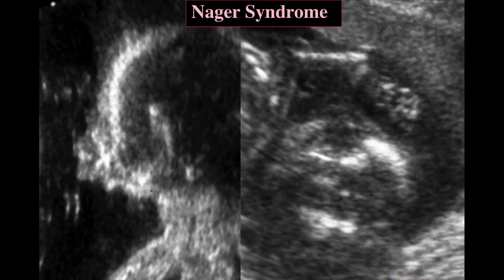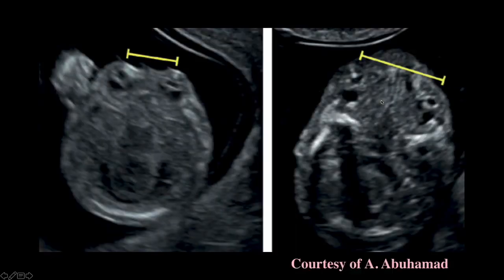This is a case of Nager Syndrome, which we had early on. You can see a very small chin. They have almost absent chins, these fetuses with Nager Syndrome. And the other part of it is the absent radius, or the radial ray abnormality, which is typically bilateral in Nager Syndrome.